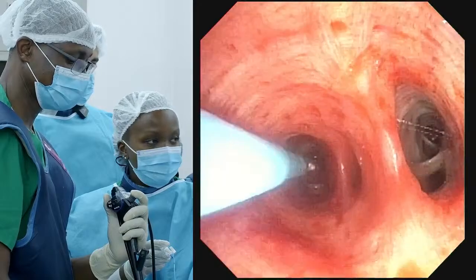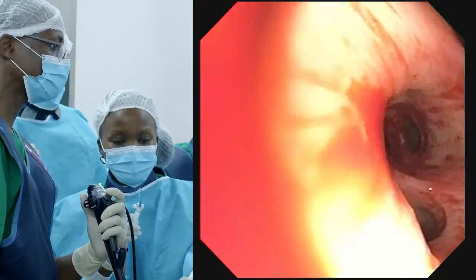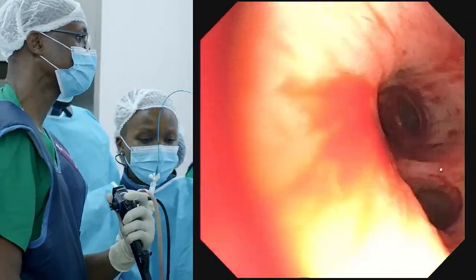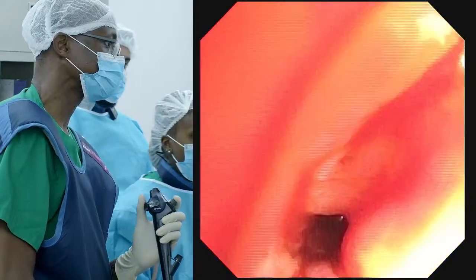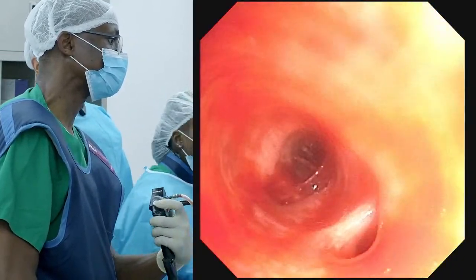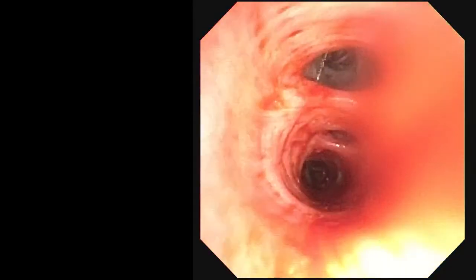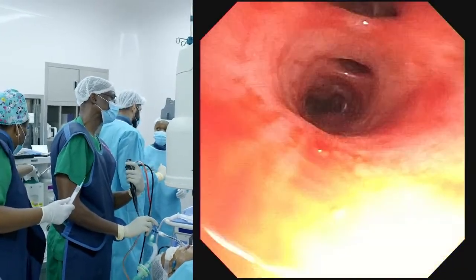Do you want me to remove the balloon now? Yeah, I think there's no. You can inspect, make sure you're okay. Okay, you're good. We're done. Yeah, Andrew. I'm happy. The bleeding is minimal. We're doing another one Monday.